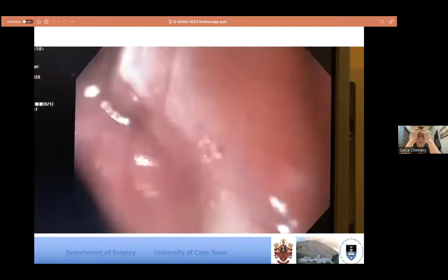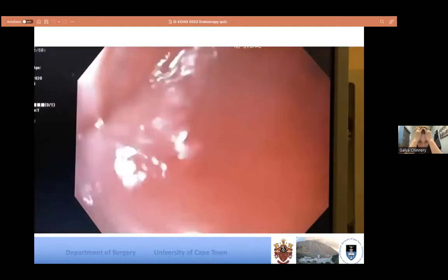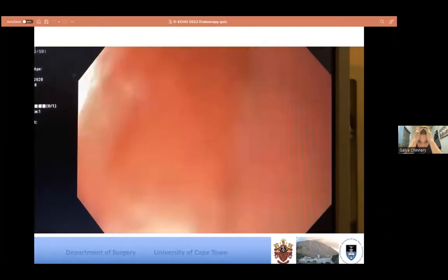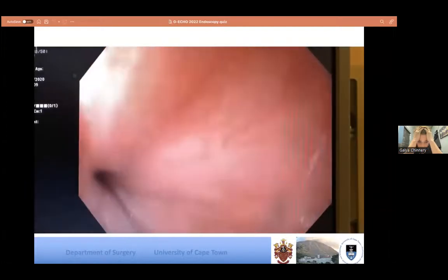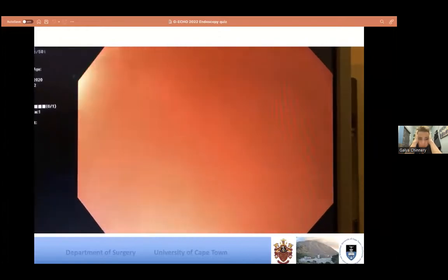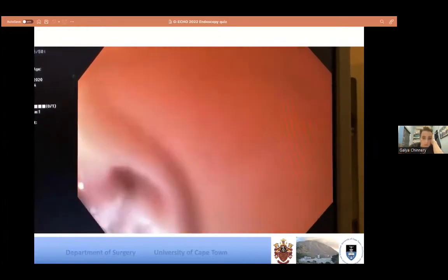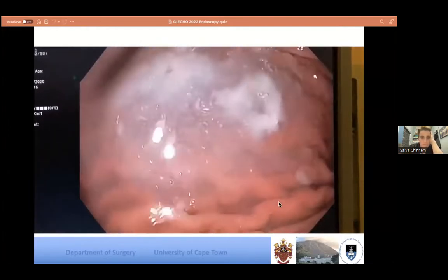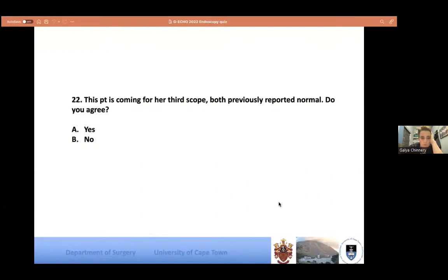I'm not giving you any history because you should be able to see what the problem is on this. And there we are through. So my simple question to start off is, do you agree that the scope is normal or not?